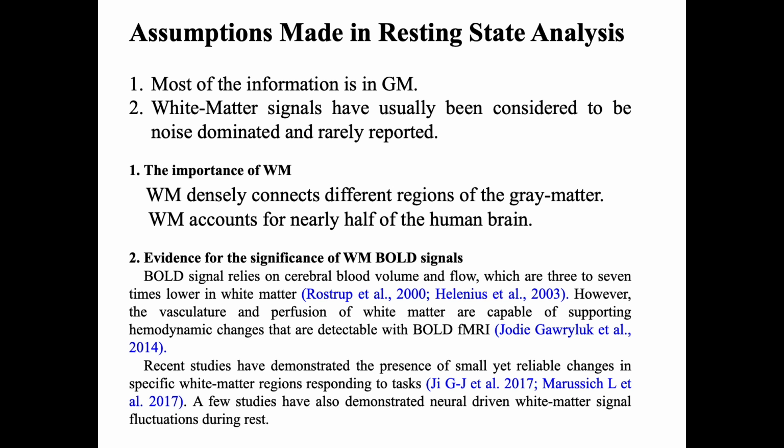So far, with resting state connectivity analysis, we have challenged the assumption that the resting state is noise, right? So in the last few minutes, I want to look at the assumptions that we have made ourselves in resting state analysis. So the assumptions, one assumption we have made is that most of the information is in gray matter, and white matter and CSF are noise dominated.